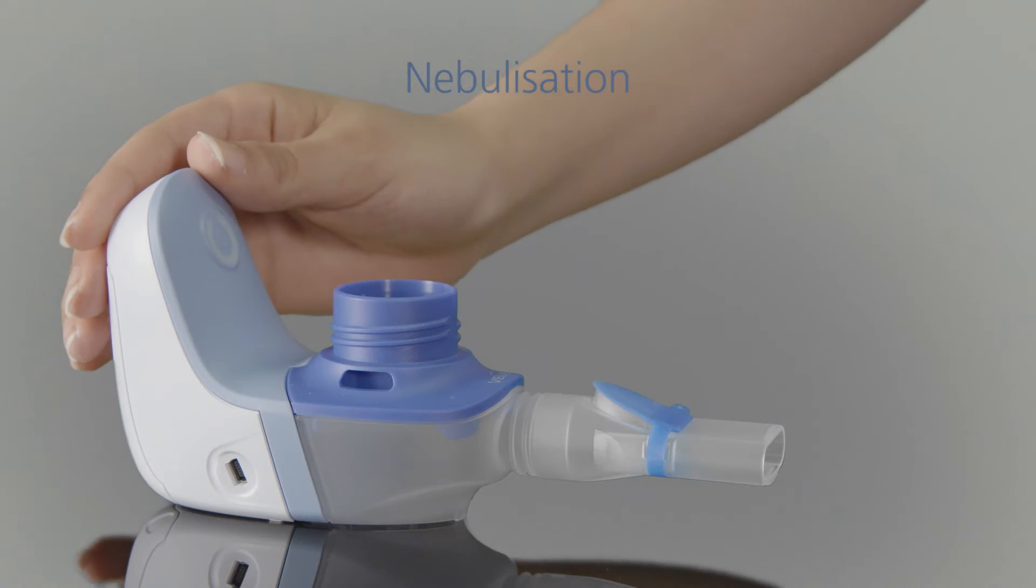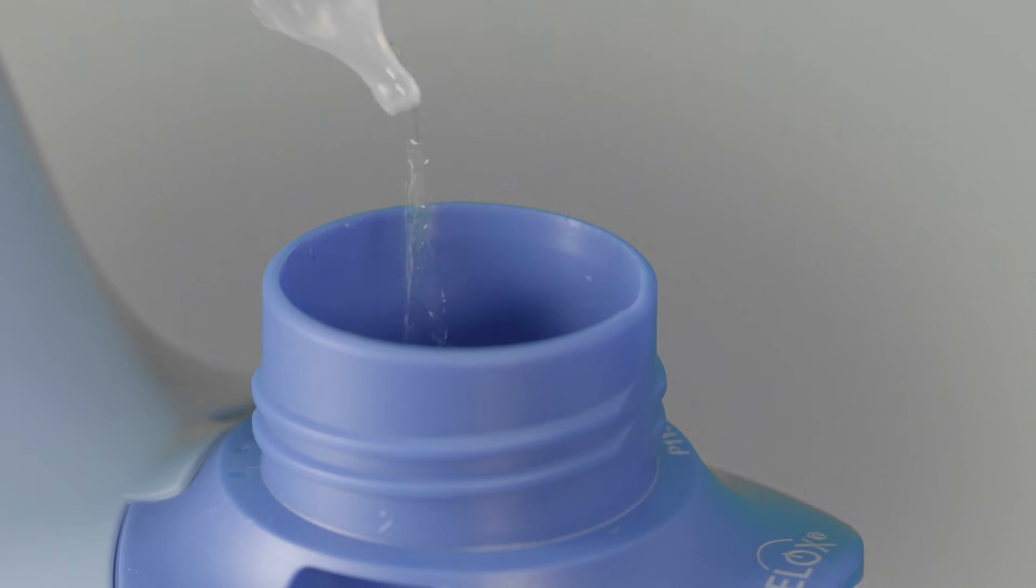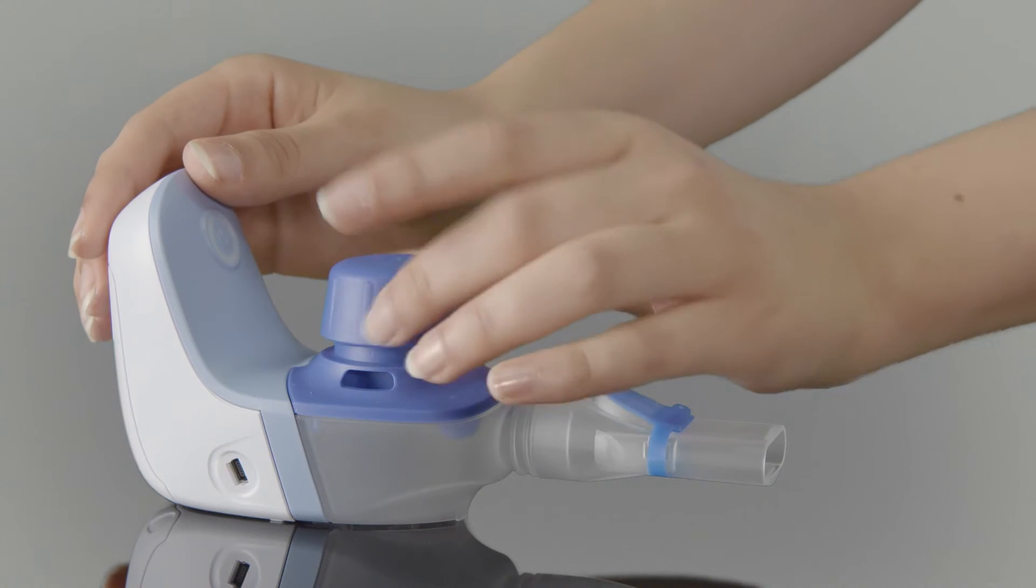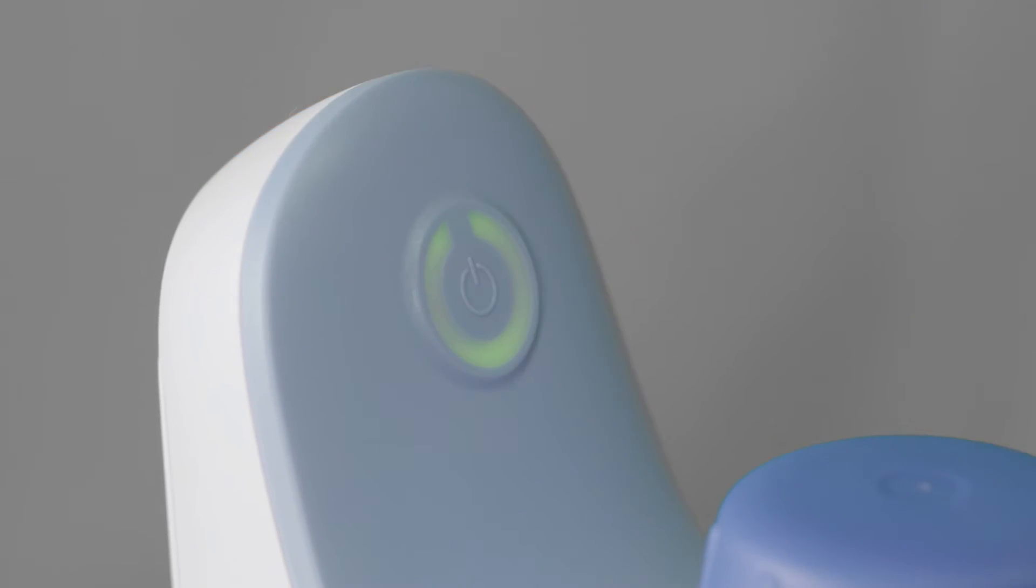Using the device is so simple. Pour the inhalation solution into the top of the nebulizer. Once finished, tightly close the lid again and switch Velox on.